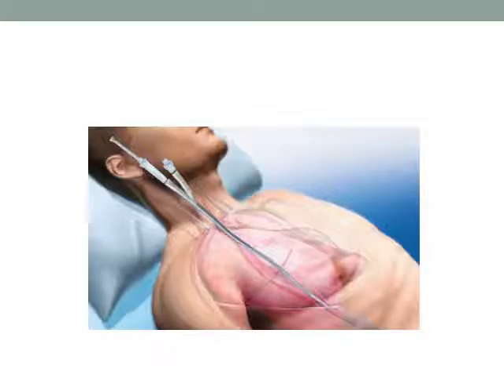Then you have a wire from the neck all the way down the IVC. You put a series of enormous dilators in it. You've seen the dilators that we use for a triple lumen. Well, we're talking about a dilator at the end that is almost a centimeter in diameter.